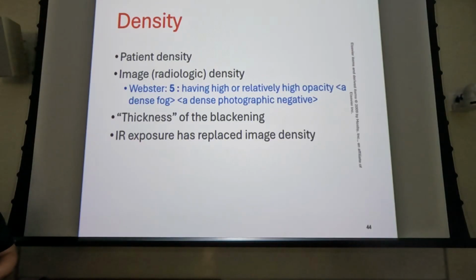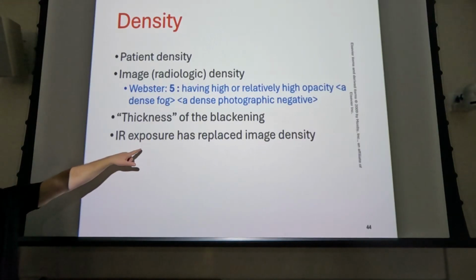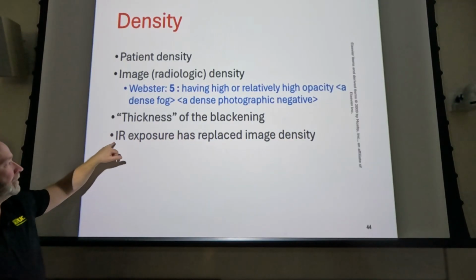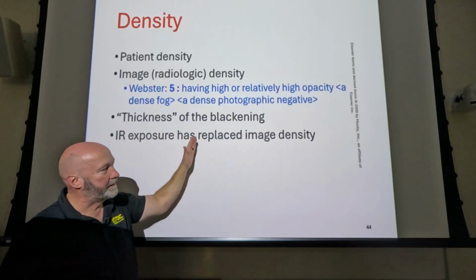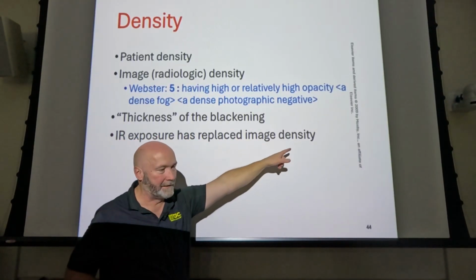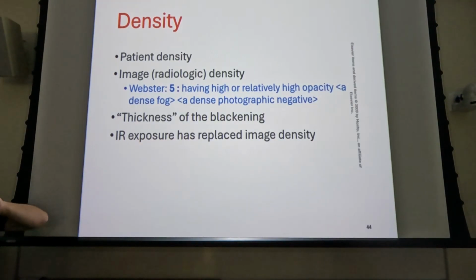Okay, so density, how dark is it? Contrast is what does it look like compared to something else? You know, you're looking at black and white here, that's high contrast. If I took this entire sentence and I went from the I being white to the Y being black, and each one was a little bit different, increasing in density all the way until it got to the black one, then that would be those densities spread out over a very wide margin.